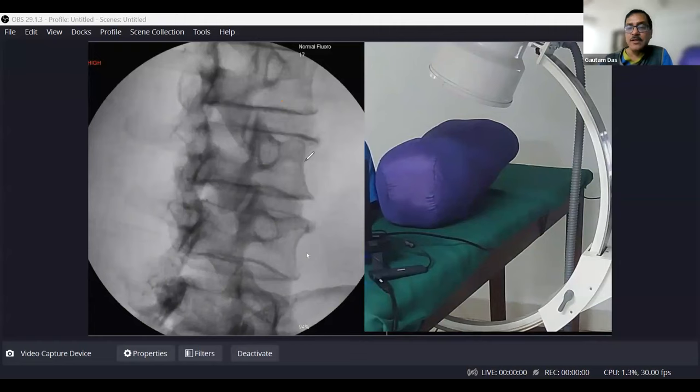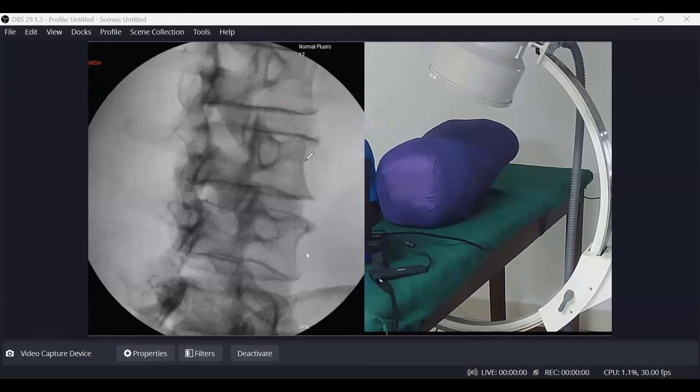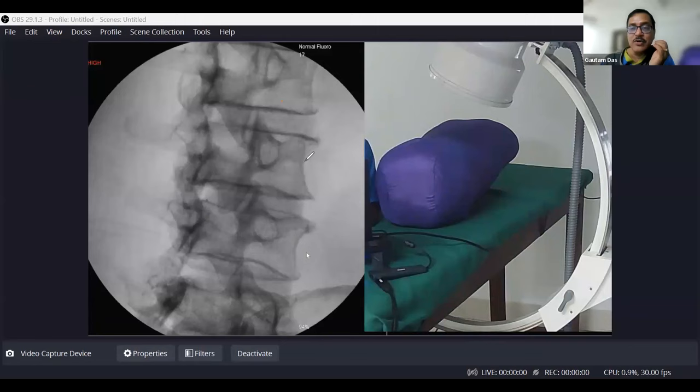Many people do not mention how much they injected, but that should be mandatory. Even if you are not seeing the same patient subsequently, he might be going to another doctor. Even then, you should do justice to your patient and mention how much milligram of steroid you have injected, because finally you should not exceed the level at which side effects and complications start appearing. So the lifetime dose is 6 mg/kg body weight and the yearly dose is 3 mg/kg. Per sitting, we try to restrict ourselves to 40 to 80 milligram. Don't go beyond 80 milligram, and try to restrict yourself to 40 milligram.